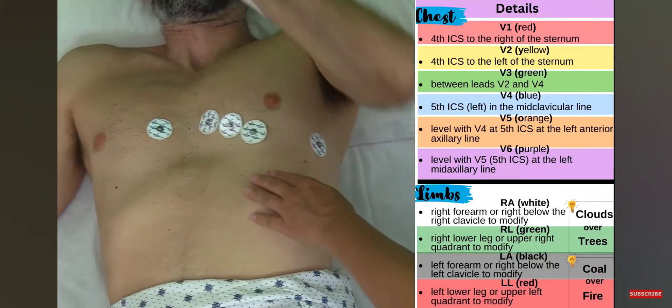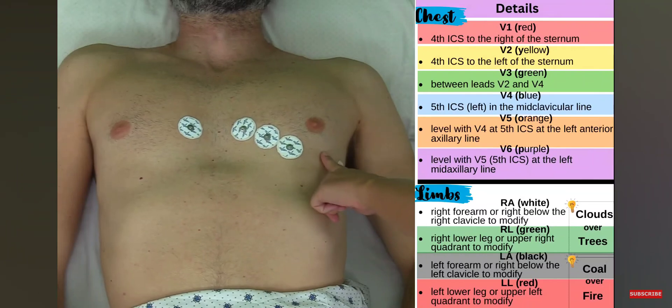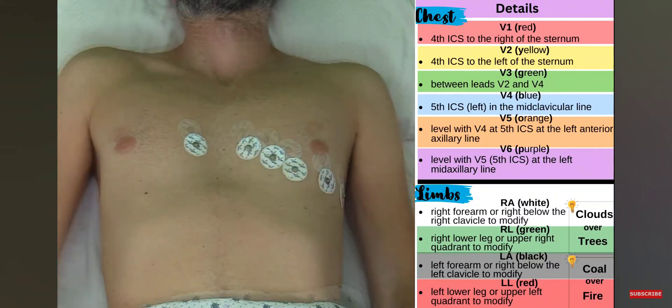Now we're going to place V5, which goes in between V4 and V6, level with those two electrodes. We're going to place it right here.